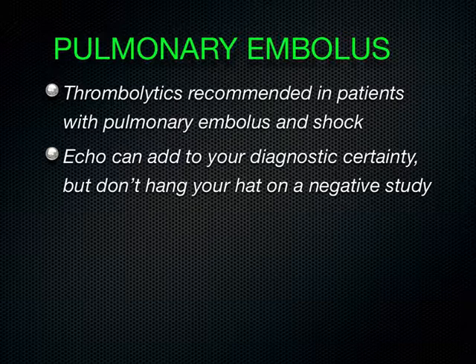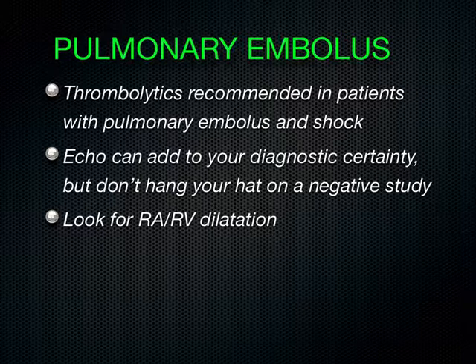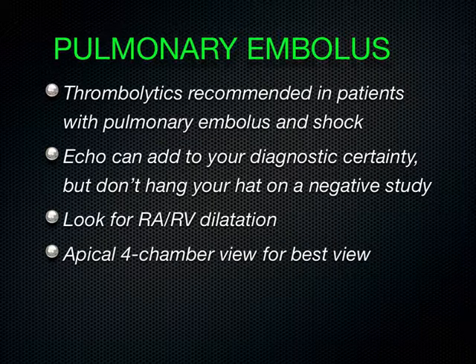Don't say, oh, I don't think it's a PE because the heart looks, I didn't see a large RV or RA. It's only when it's positive that it helps you out. And that's true for a lot of things we do in emergency ultrasound. We can rule things in that case.